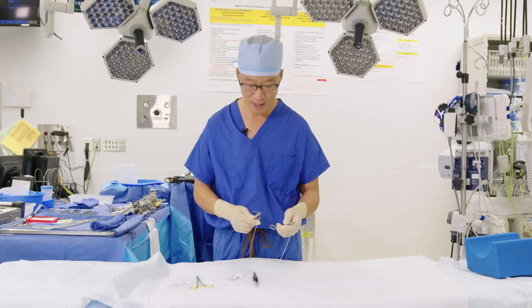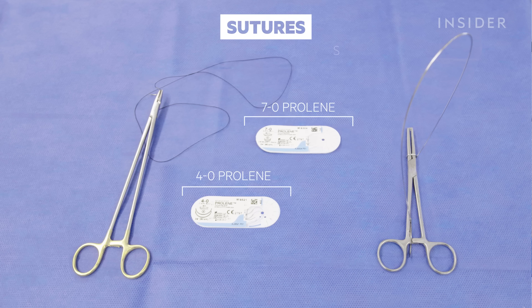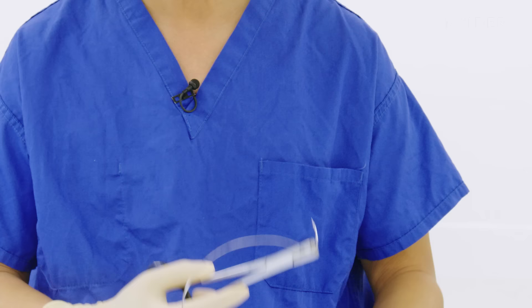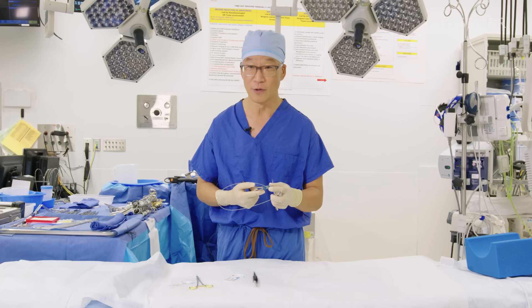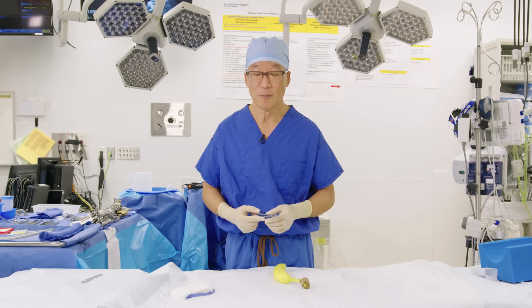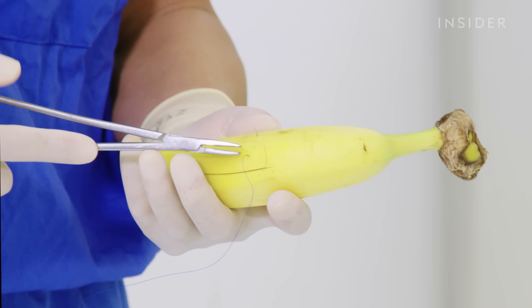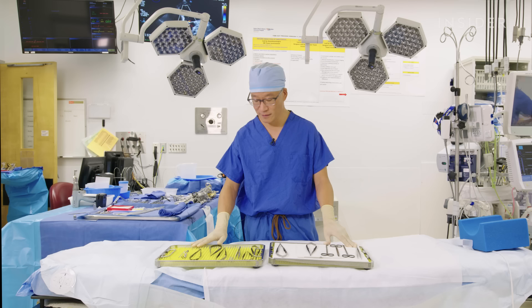At the beginning of the operation, we divided the breastbone, so we need a means to put that breastbone back together. For that we use stainless steel wires — it has an extremely sharp needle and a very heavy needle driver — and this goes through the bone and is twisted to re-approximate the breastbone. These wires are permanent as well. Needles are curved so that we can go through and come out on the other side without distorting the tissues.